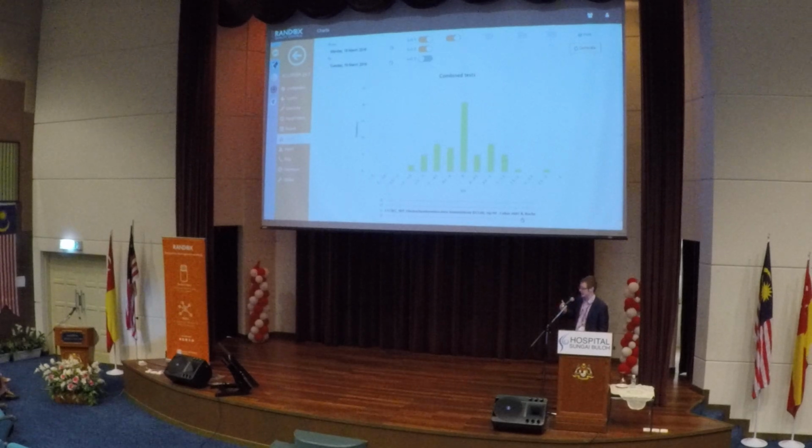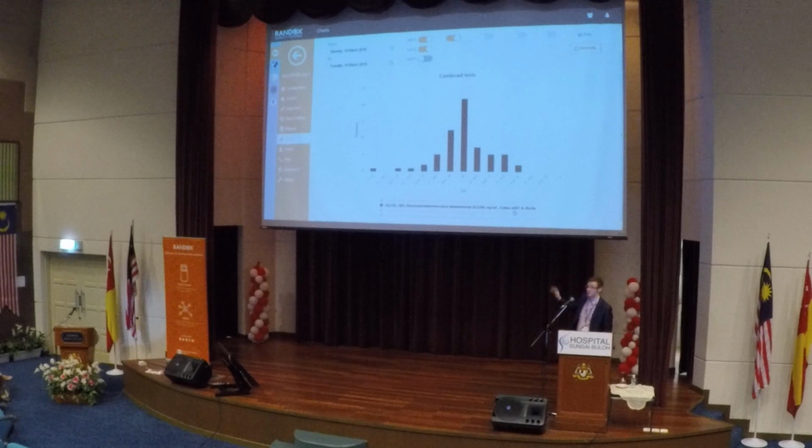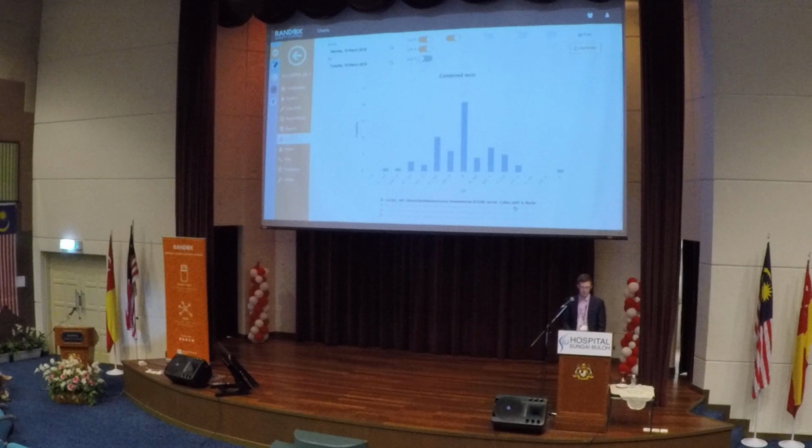Again, we can see here our performance is fairly normal, above and below the mean. We do have one result which is falling between the 2.5 to 3 SDI range, so that's something you want to keep an eye on, but again, nothing too terrible happening there. Then if we look at the results from Lab 1, again, it seems to be a fairly normal distribution of results, so everything seems to be okay. And for our blue test, again, the same thing. Performance is fairly standard across the board. So it shows that for Lab 1 and Lab 2, everything seems to be going quite well.